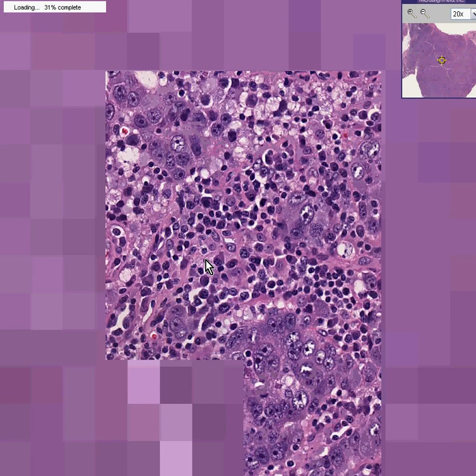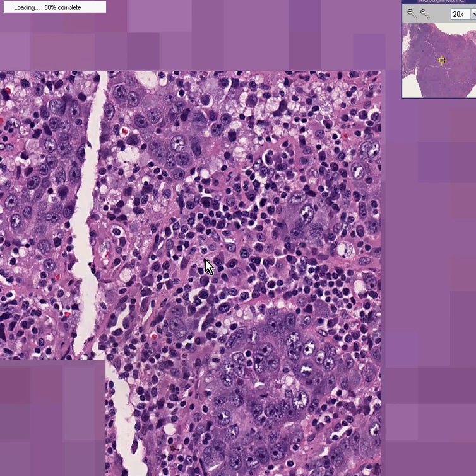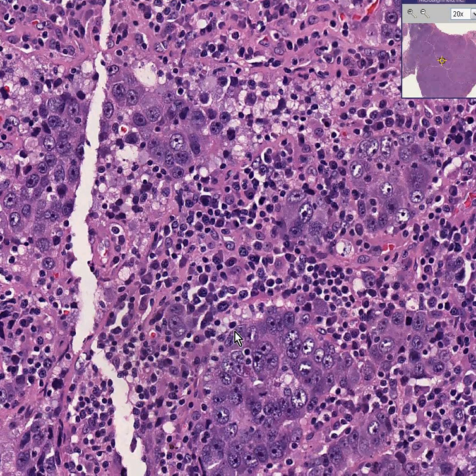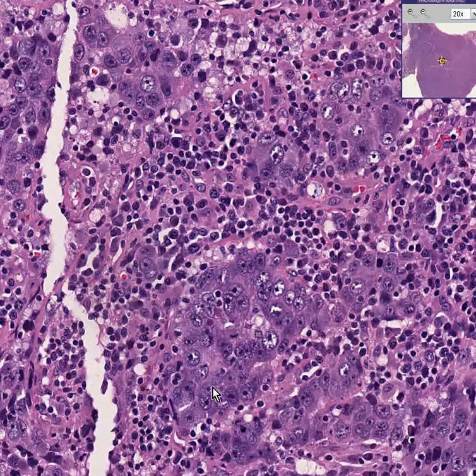And they have all of the classical features for malignancy. It's not like lobular carcinoma or some of the intraductals when the nuclei don't look terribly bad. You should be able by now to look at little clusters of cells like this and just instantly say malignant. They're big, they're irregular, they're dark. They have nucleoli that are about as big as your basketball, but there are probably even a greater amount of lymphoid cells surrounding this. And of course, you know this is just a little crack artifact.